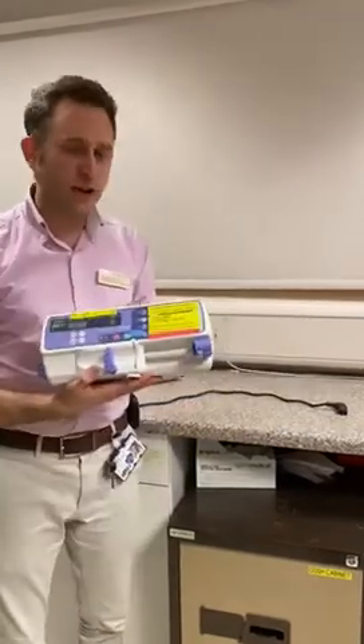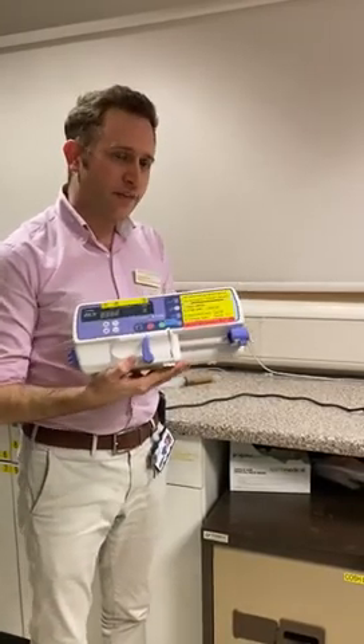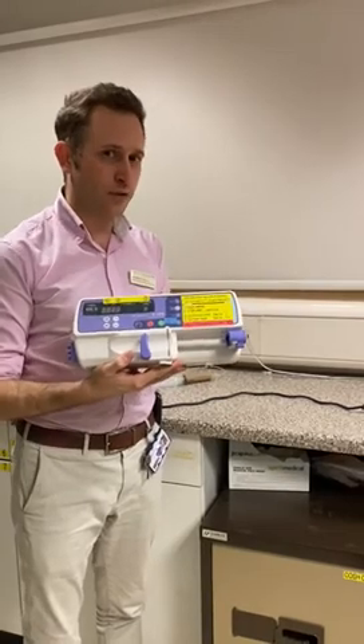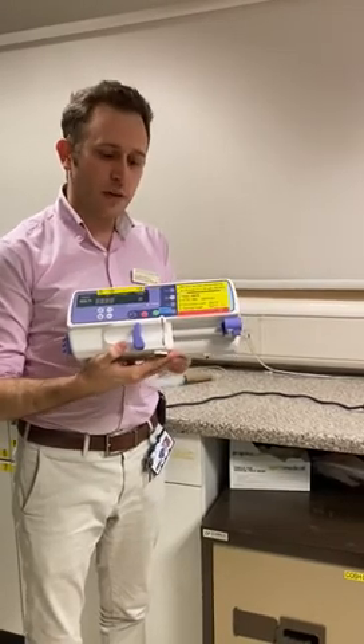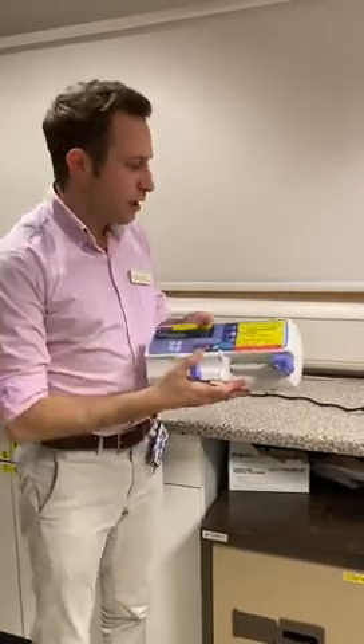Hello, this is the Graysby 2100 syringe pump. We have 220 of these because if we continue with ICU surge much longer, we're not going to have enough of our normal syringe pumps. These are very basic — they only operate in millilitres per hour — but that's okay because pharmacy have changed the prep guide to make it really clear which drugs we can give safely with these pumps and they've made it really easy to do the calculations. So we're going to be using these for low-risk infusions only.